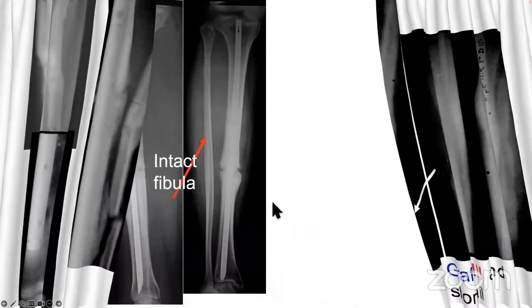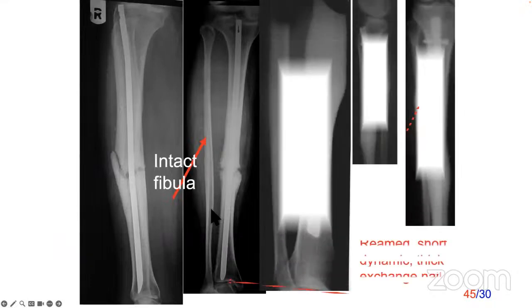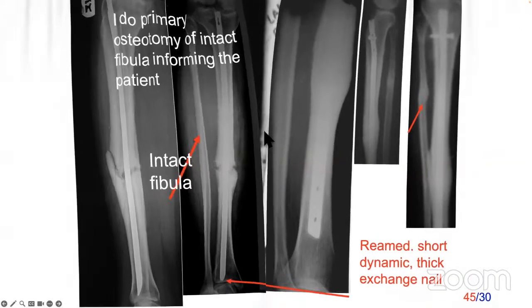So today, my approach is, here it is again the same thing. A nail, intact fibula, went into non-union. You put in a short nail, dynamize it, and the fracture heals up with the fibular osteotomy. I do a primary osteotomy of the intact fibula, informing the patient. Again, it's an overkill, but I do this. If I do this nailing, I do the osteotomy somewhere away from the fracture and do the nailing in dynamic mode in a transverse fracture. This is the one which heals up.